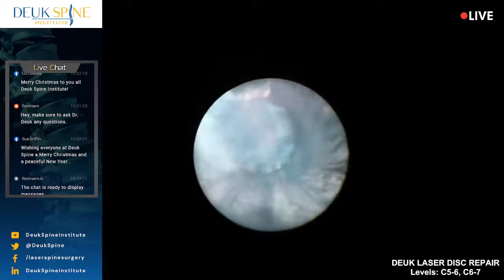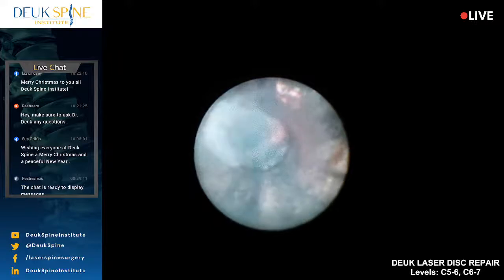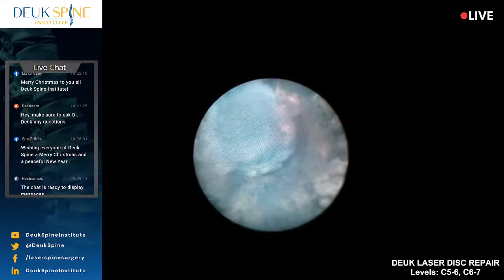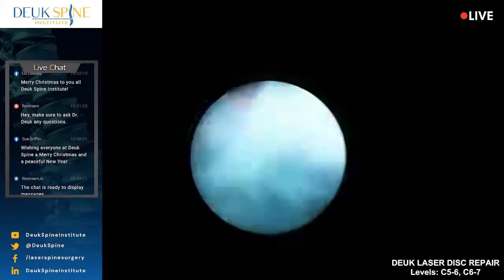But we found the source of the inflammation to be the tear here at Deuk Spine, and we treat that tear and get rid of the inflammation. All right, lasers on. Here we go.